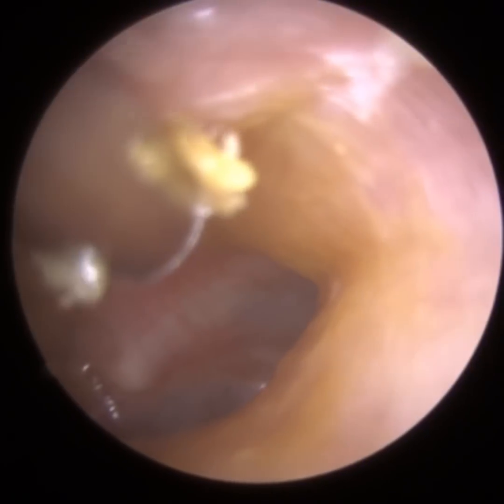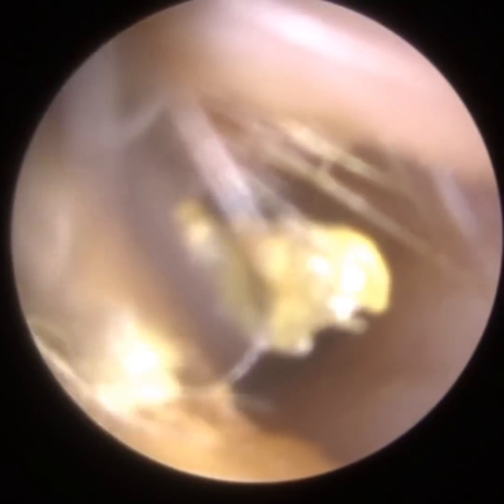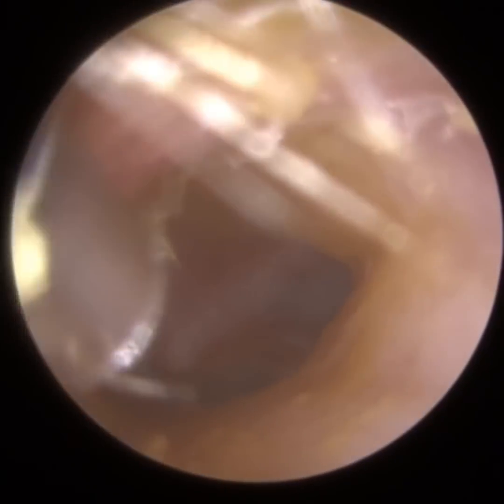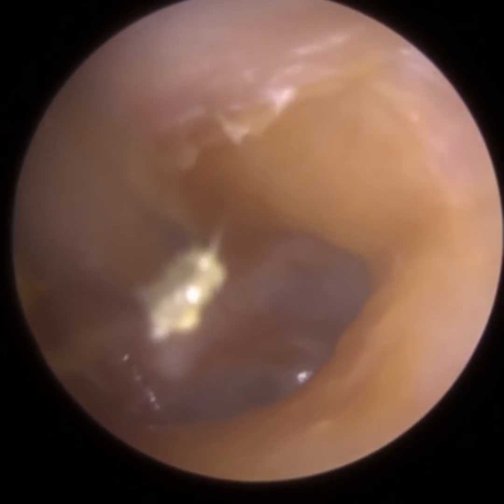So we've cleared the blockage out, just some dead coating around the side, so just using a fine angle. Patient did get a bit dizzy, a bit of caloric effect that can happen. So you've got an organ of balance in both ears. They send messages to your brain.